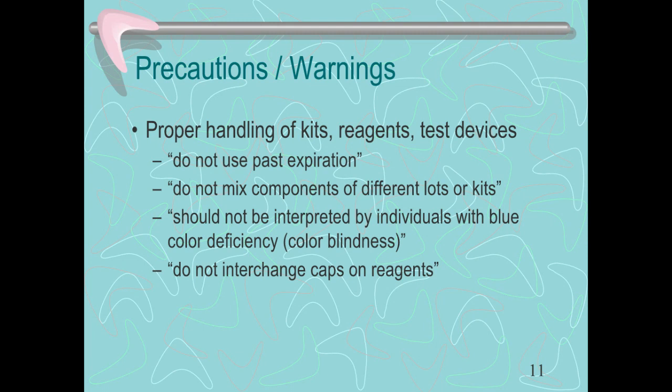So maybe you still have some reagent from a flu kit, and you have some more, and you're just going to do swabs. That's not how that works. That reagent is only valid with that particular kit. You want to dispose of them once the kit's empty, even if you have a few drops left.